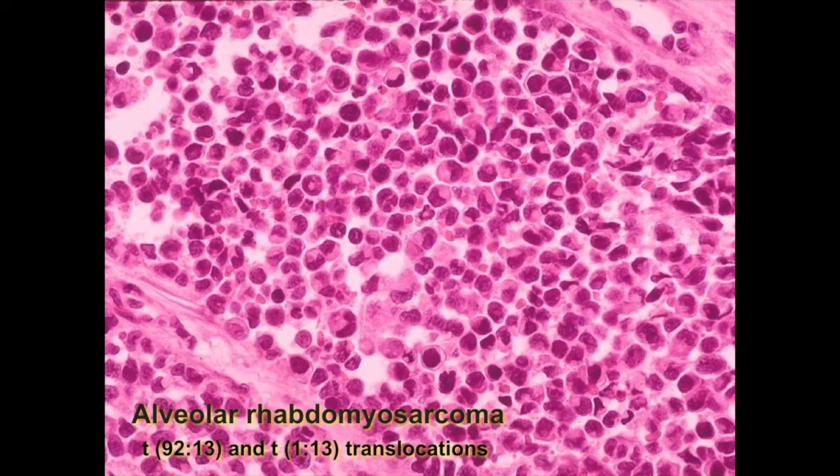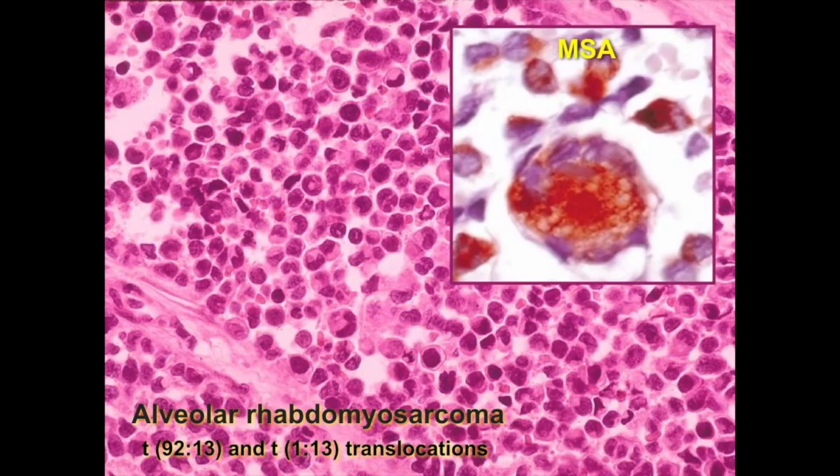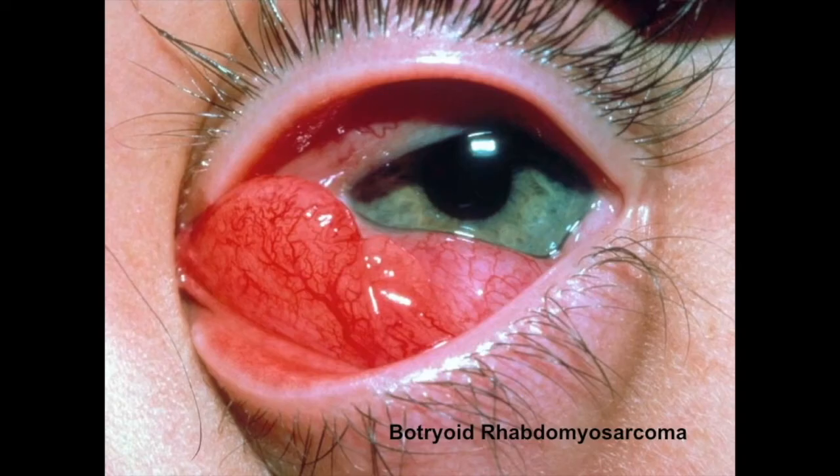Here's our example of an alveolar rhabdomyosarcoma. These epithelioid rhabdomyoblasts fill these spaces demarcated by septae, which are sort of reminiscent of the alveoli in the lung. And we discussed the translocations already. This is showing a positive muscle-specific actin stain.